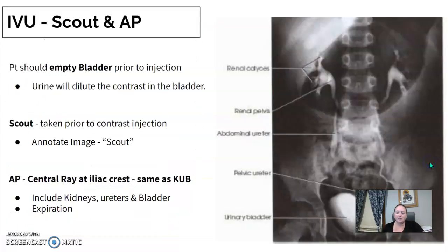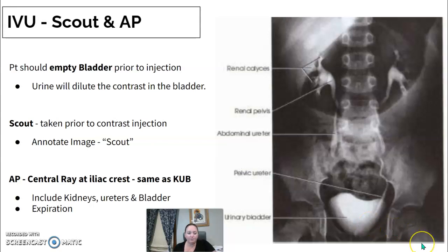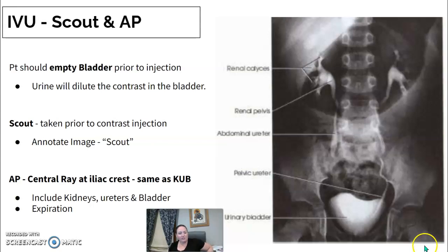The scout abdomen is a standard KUB. For IVU, the patient needs to empty their bladder first — if we inject contrast and they have a full bladder, the urine will dilute the contrast medium. The scout is marked as such and is an AP projection just like a KUB, including the kidneys, ureters, and bladder, taken on expiration as usual.